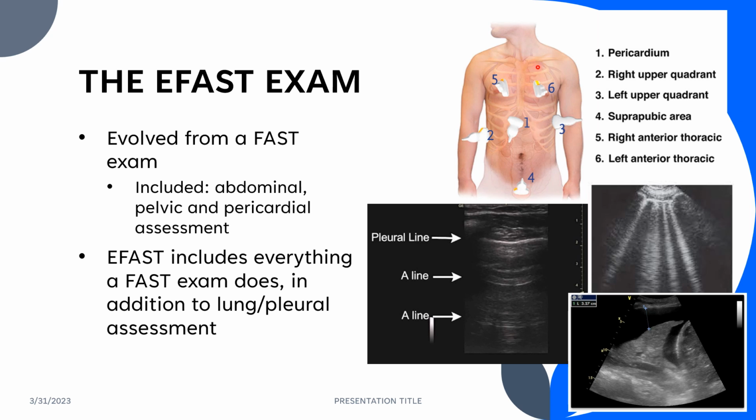So if you have a high concern that there could be some fluid collection towards the apex of the lung or somewhere mid lung, then you need to slightly roll that patient into an LPO or an RPO and then access it from the posterior aspect of the body, because accessing it from the anterior aspect won't allow you to see what you're desiring here.